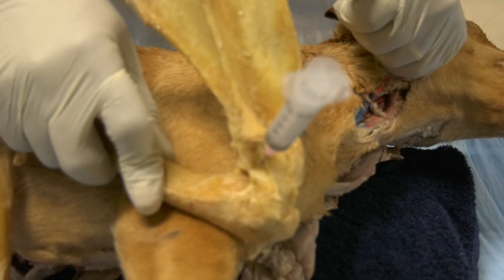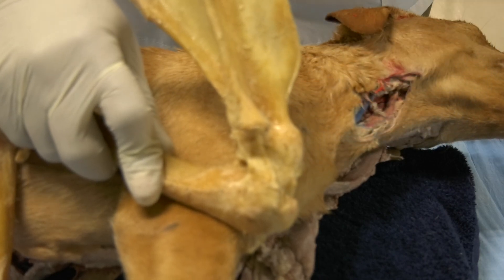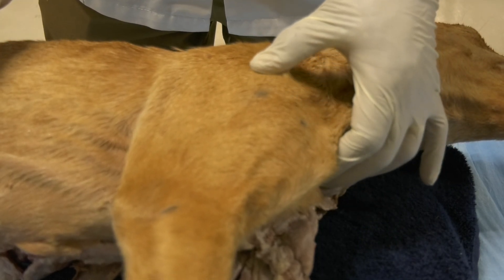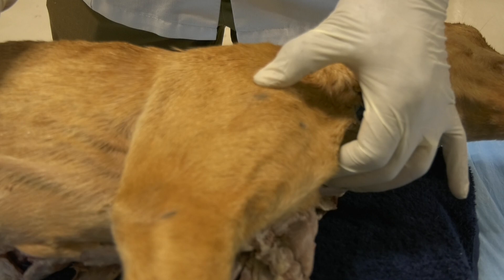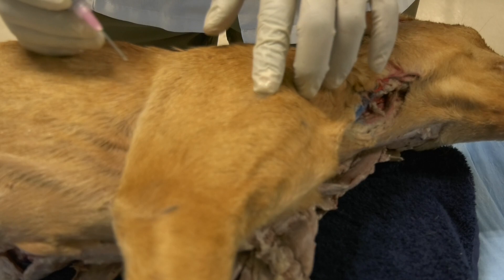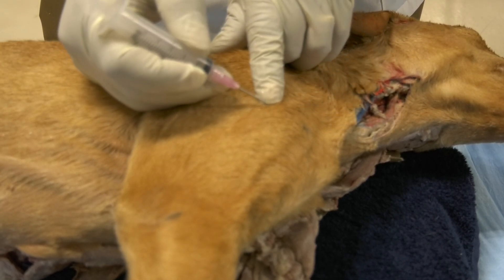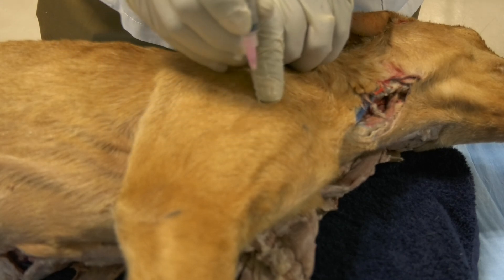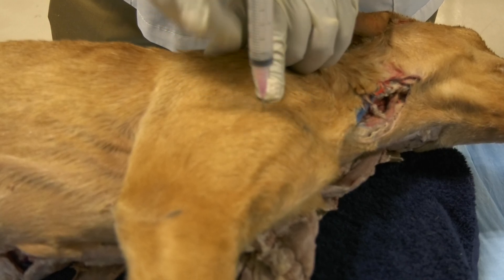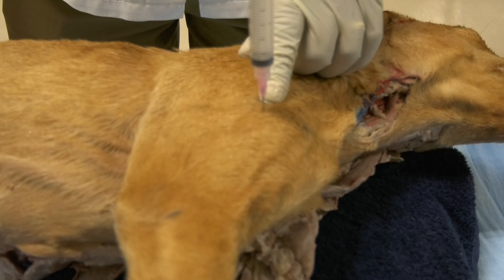By doing that, you will access the joint cavity. Let us simulate that in the live dog. You feel the scapular spine, you go distally until you feel the acromion — this dot here is the acromion. Then you go a few millimeters distal to the acromion and insert the needle perpendicular to the skin in the medial direction. This will give you access to the joint cavity.